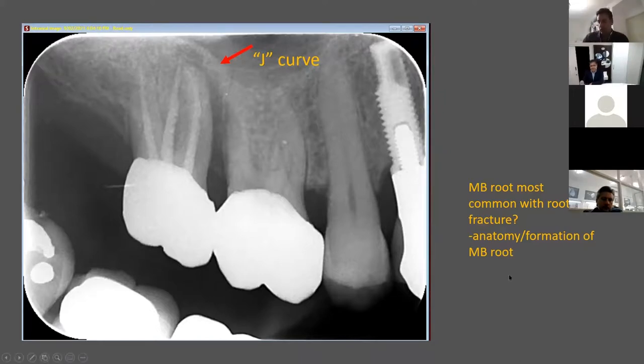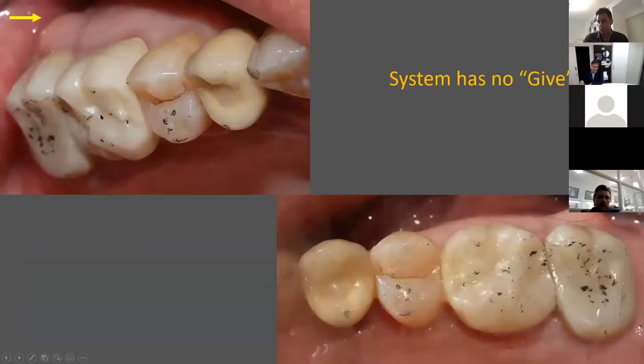The patient should be warned. Let's look at this patient from an occlusion point of view. I like this. I've taken my time taking these photos, and I'm a photographer freak. I like having good vision. I'm a very visual person. We teach how to be visual. Then you can see that this is an implant.